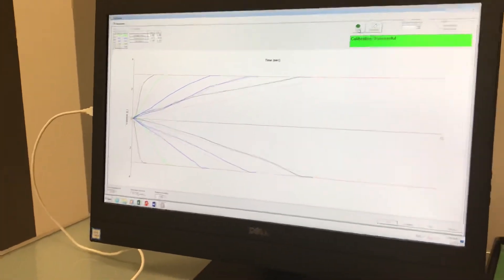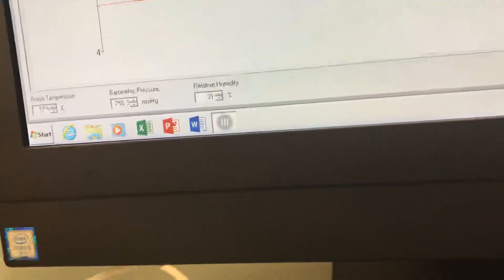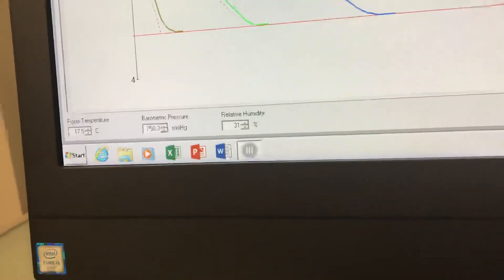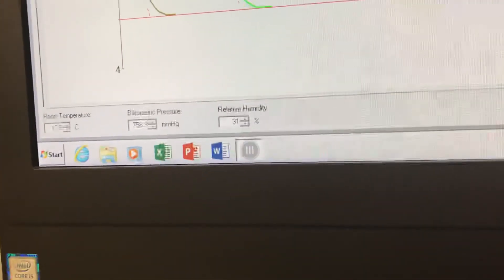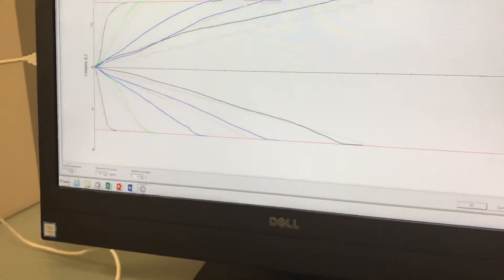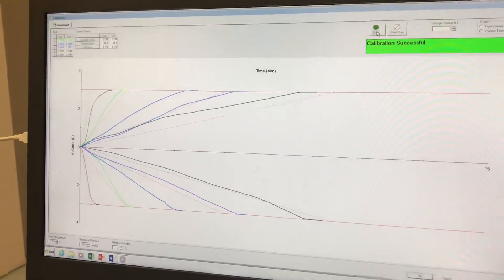Some other things to point out: depending on the model of spirometer that you have, you may want to input the temperature, barometric pressure, and relative humidity. Your PFT lab would have this information, or there are also apps you can put on your cell phone that will give you this information as well. As you can see, my office is a balmy 17.5 degrees this morning. But this will help with your calibrations and make them a little bit tighter.